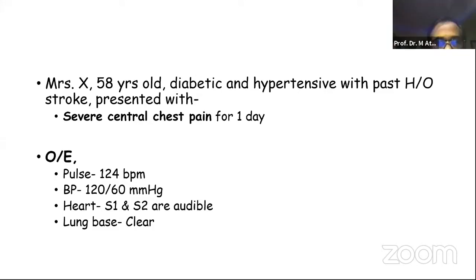The previous is the management plan about the complete heart block, and now finally the patient has first degree AV block. During the time of MI, there is transfer, cath lab, temporary wire, PCI, reperfusion, but this looks a little late. From the electrical point of view, the patient is okay, first degree AV block. But the question is, what do you do about revascularization? Now this is 3 days post.